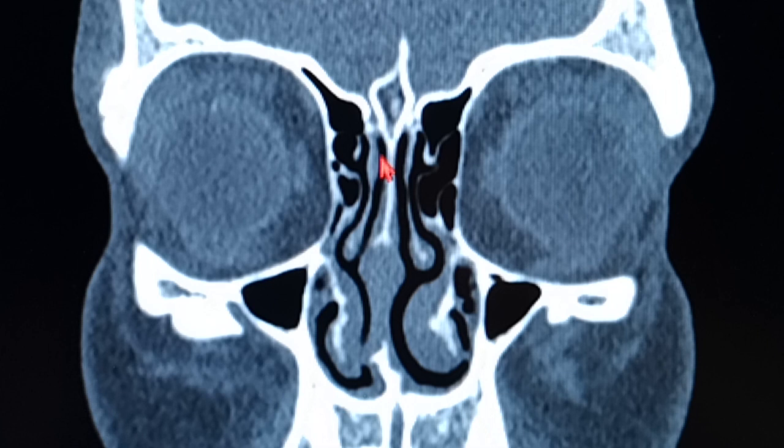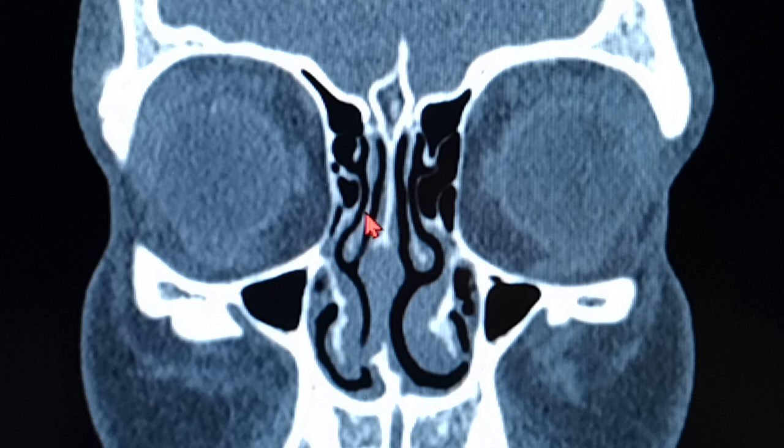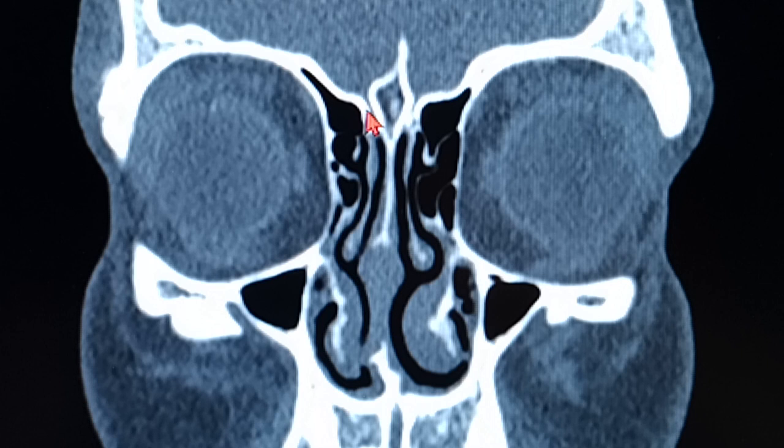Or after opening the sphenoid from the medial approach, if you medialize the middle turbinate too much onto the septum superiorly, there will be no air passage, the olfaction will be completely cut off, and the normal smell sensation will be gone. So this is basically the rough anatomy of the cribriform plate, and the height of the cribriform plate depends upon the height of the lateral lamella.